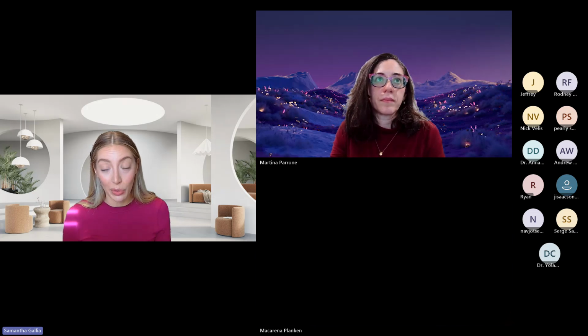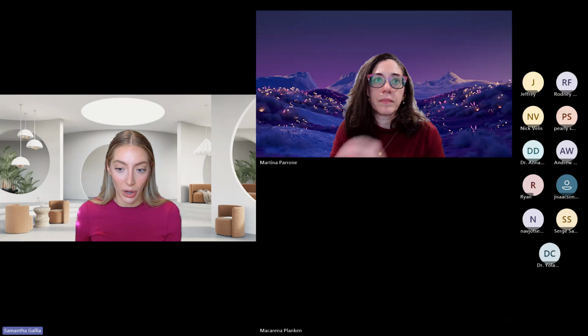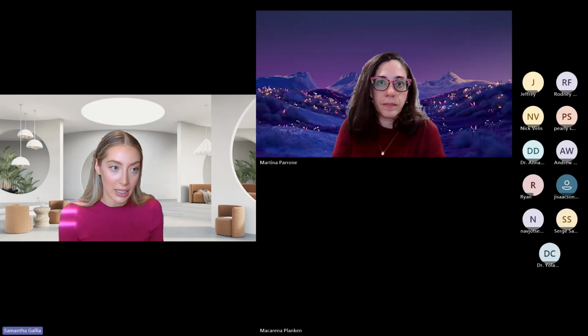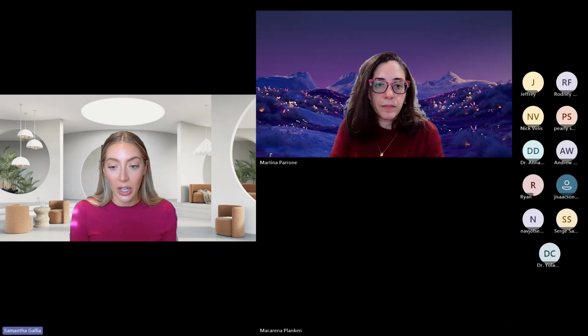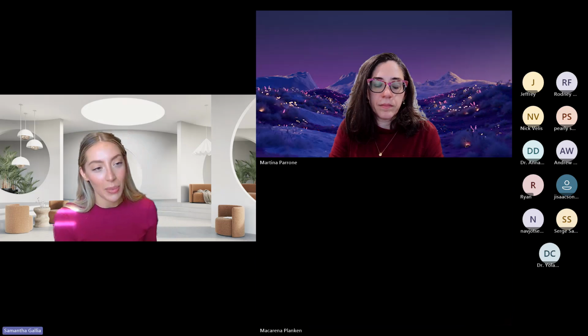So vertical root fractures are really tough. Obviously, if you can't see them on 2D radiographs, it is indicated to take a CBCT. It's very important to know that CBCT cannot always visualize vertical root fractures because it depends on how large they are and the location that they are. And if the tooth is obturated, sometimes that can create some of the artifacts that we talked about previously. So the answer is, if one is present, you may be able to see it.